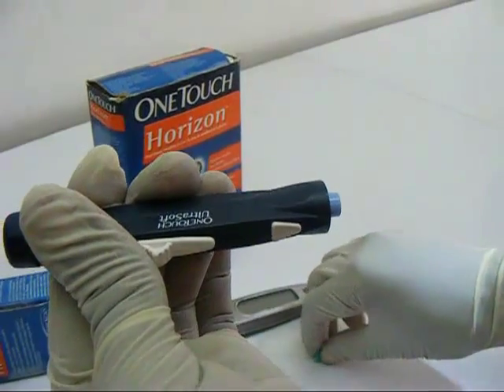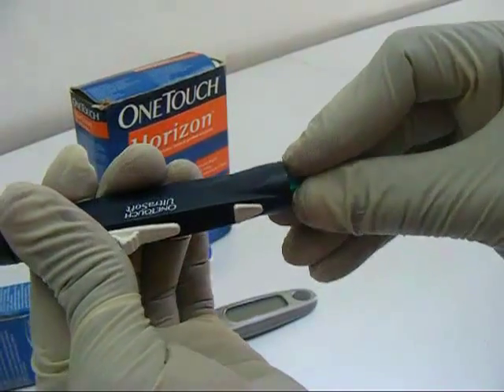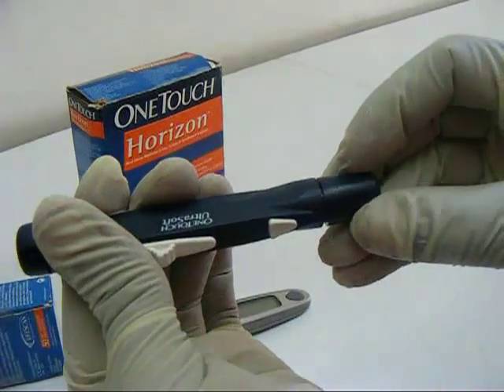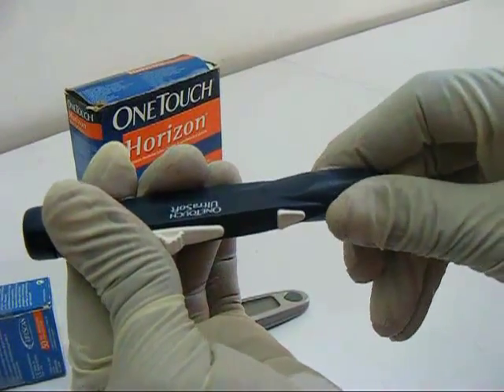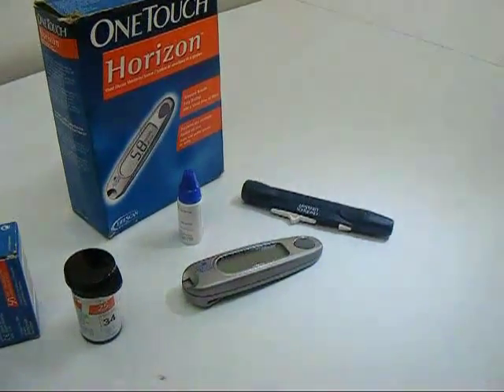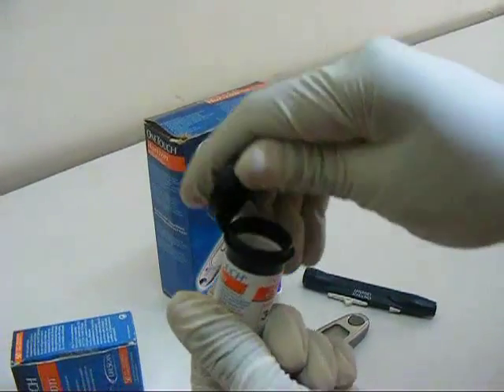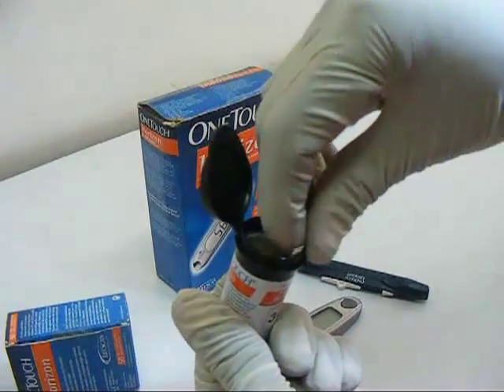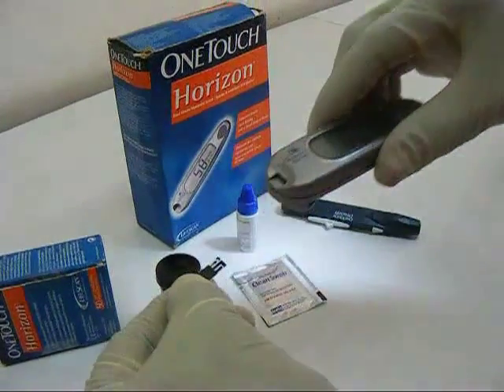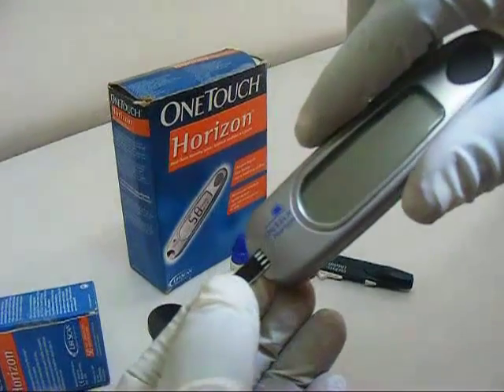The lancet is fixed onto the lancet holder and made ready for use. The glucose test strip is inserted into the glucometer. The electronic code registers and the meter is now ready for use.